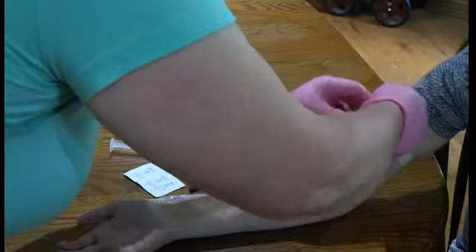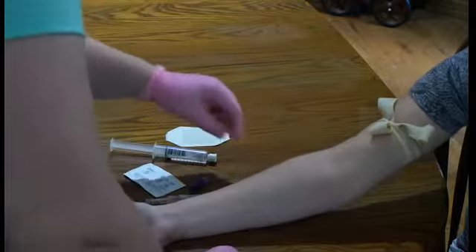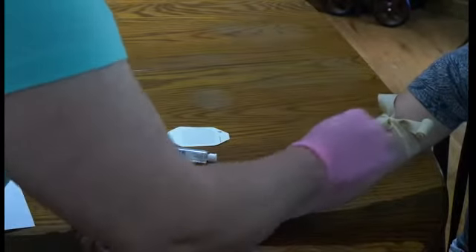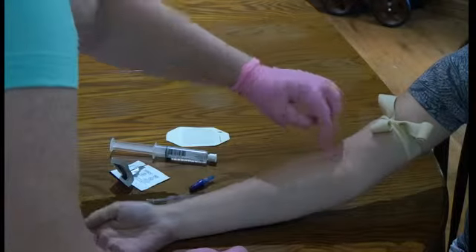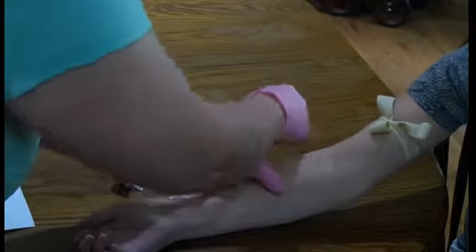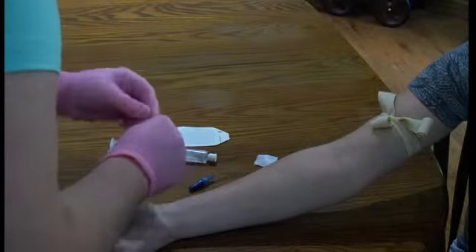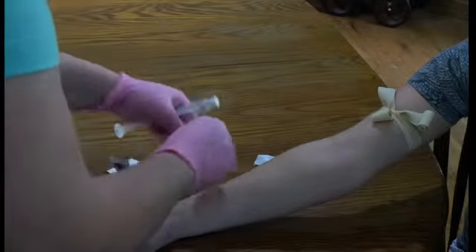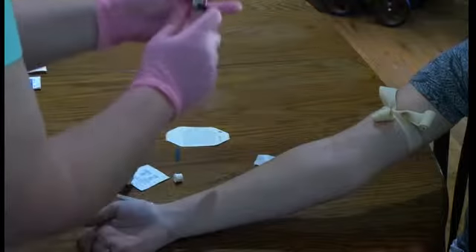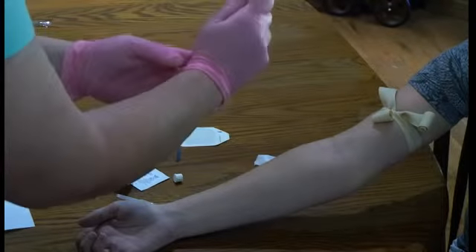So how we're going to do this is we take the tourniquet and place it around the patient's arm. Generally, and I will say especially out in the field, the best place and the first place to look is always the AC, because that's going to be the easiest and fastest way to get an IV started on your patient. You're going to take an alcohol swab and clean the area. And what I like to do is prep my heparin lock and my saline, so I can stick it on there and get it ready to go.